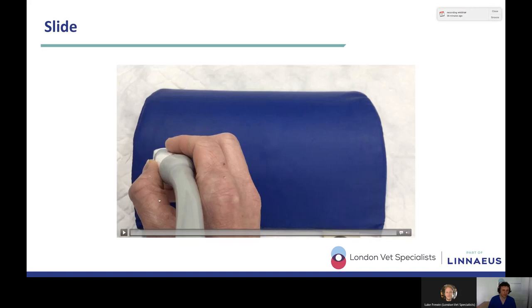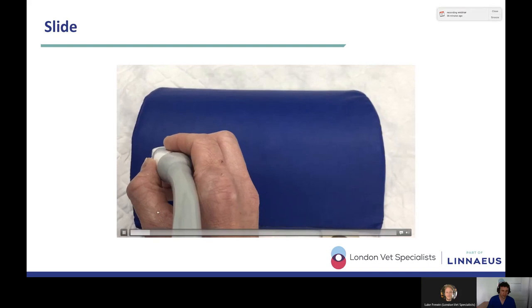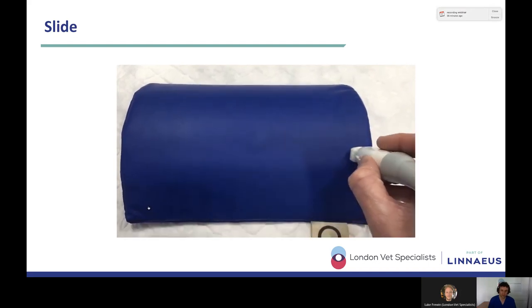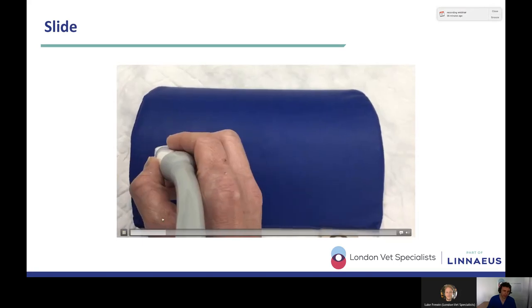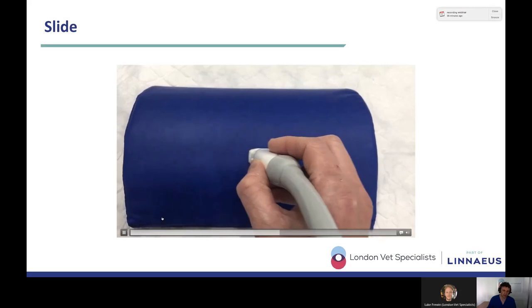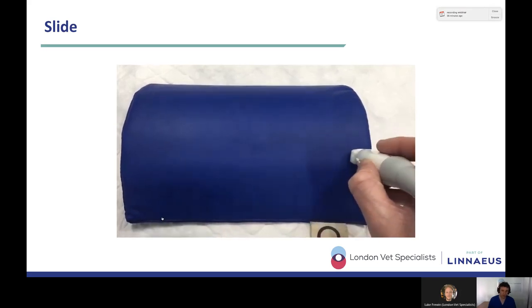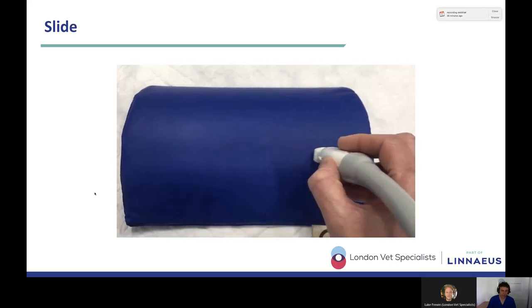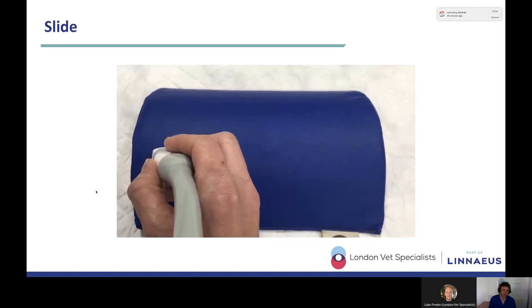So let's go into how we move the probe. The first movement is the slide, and it looks a little bit like this. You fix the probe and you slide it along the patient. We're not moving the probe in any other way here, other than in this instance to move it from cranial to caudal. So there's no rotation, there's no fanning, we're not changing the pressure that we're putting on the probe. We are just simply sliding it from one end to the other. And that's our slide. So that's the first one of our five movements.